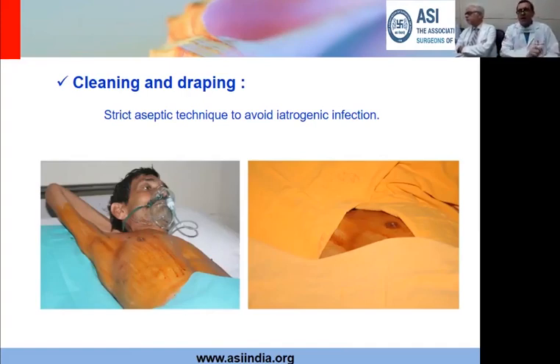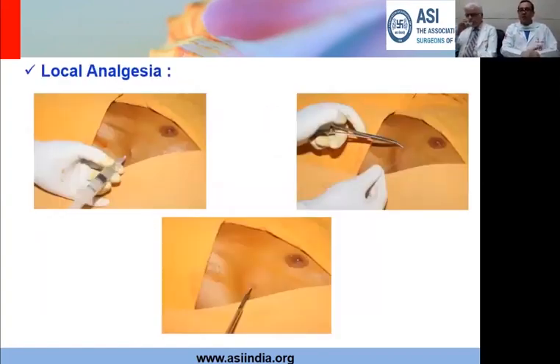Now, many times, friends, I have seen just one towel being put on the inferior side, and then superiorly, medially, laterally, everything is exposed. There's no way you can avoid your gloves touching the unsterile area and you end up breaching the asepsis. That's not correct. That's not the right way. Please do get extra drapes, and please see that this area is covered properly.